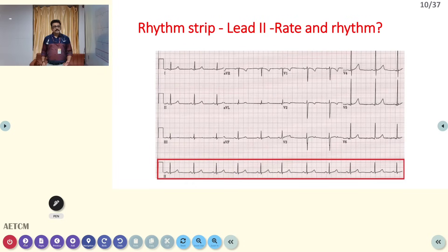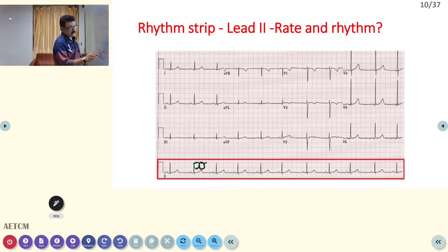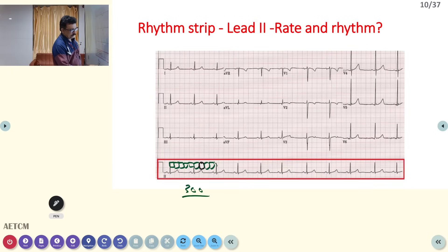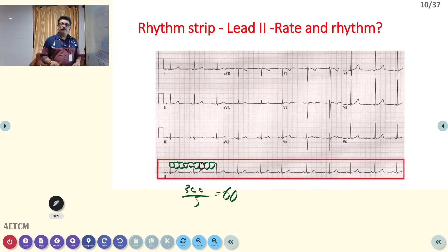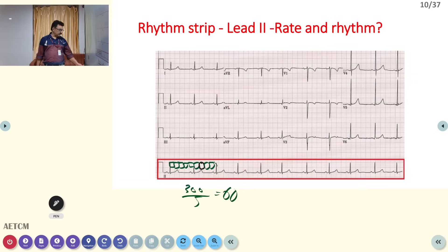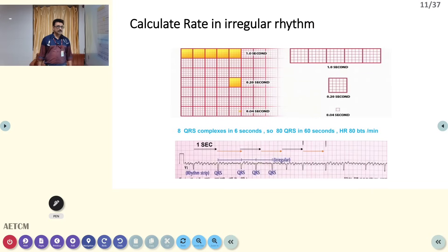Applying this method: counting 5 large squares between two QRS complexes, 300 ÷ 5 = 60 beats per minute. So the heart rate is 60. If the rhythm is regular, this method applies throughout the ECG. If the rhythm is irregular, you cannot use this method — there is another approach for irregular rhythms.